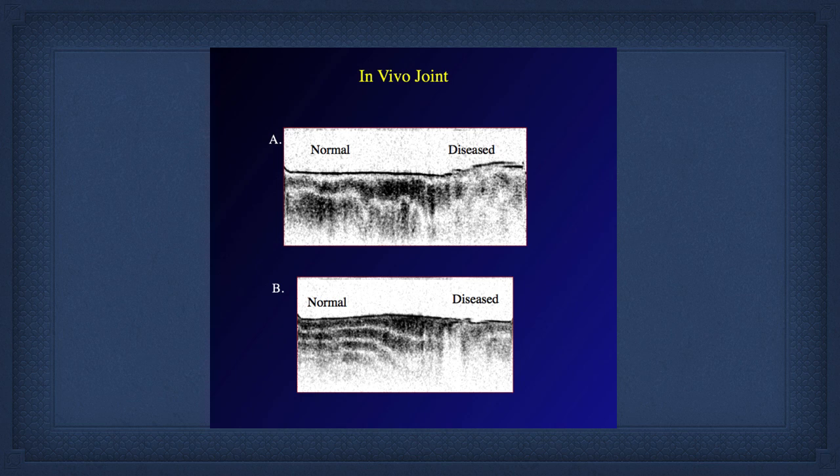For instance, bending the optical fiber will change the polarization measurement. So will heating up the fiber. Whereas we look at a relative here, and this is from an in vivo study published in 2010. These are human joints. It was a 2006 study.